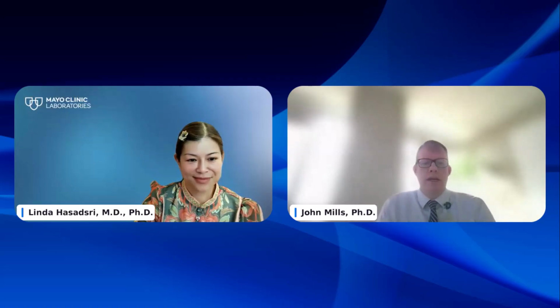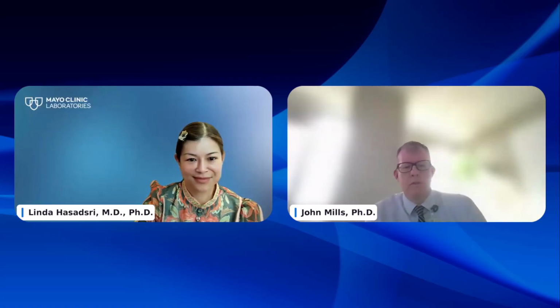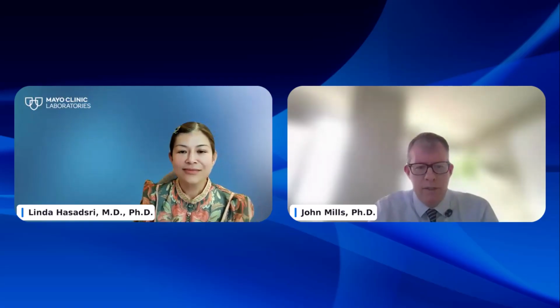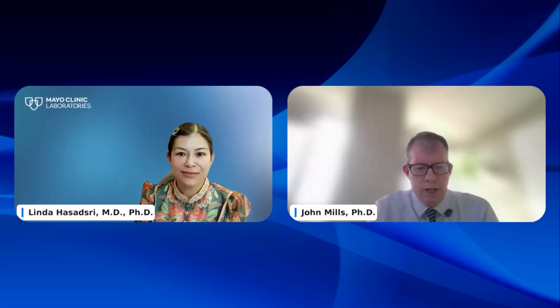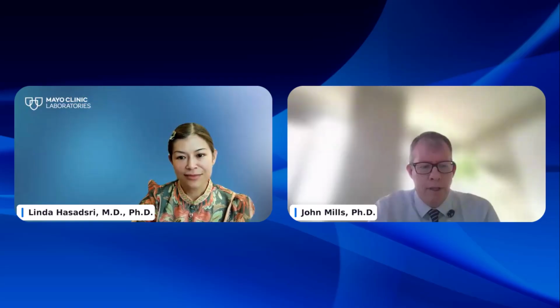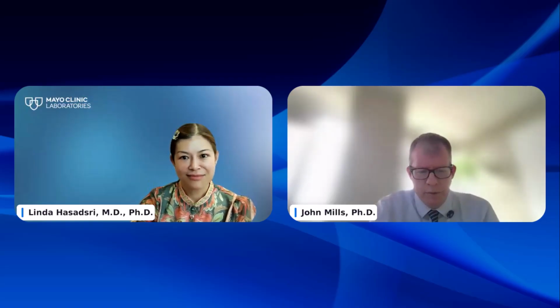Yeah, so I have to preface that there's two parts to my lab. There's the part that does routine testing, and then where we perform RT-QuIC testing, we have some additional safety mechanisms, mainly because we're amplifying the product. There's the potential that we may get an autopsy CSF sample, a postmortem CSF sample, which carries more risk.